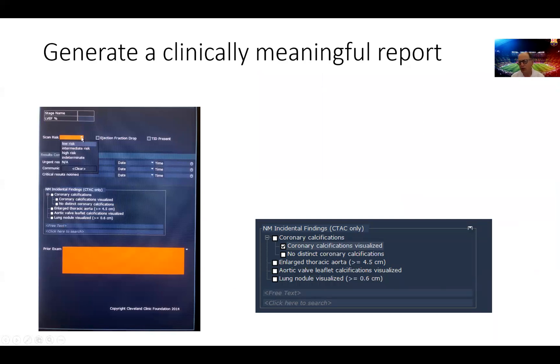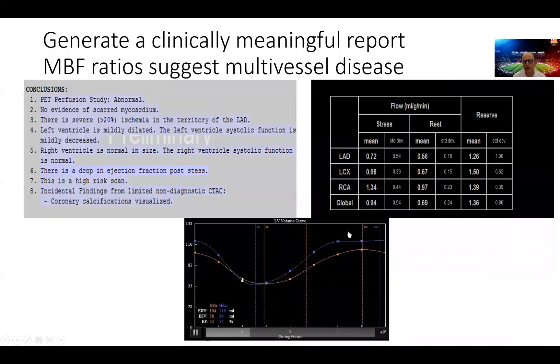And finally we get to the point where we have to report this test for risk. This is a patient with a lot of high risk markers. So this is a high risk study with a drop in ejection fraction and TID. The patient did not have a prior test to compare it to, but we comment about the coronary calcification in this patient.